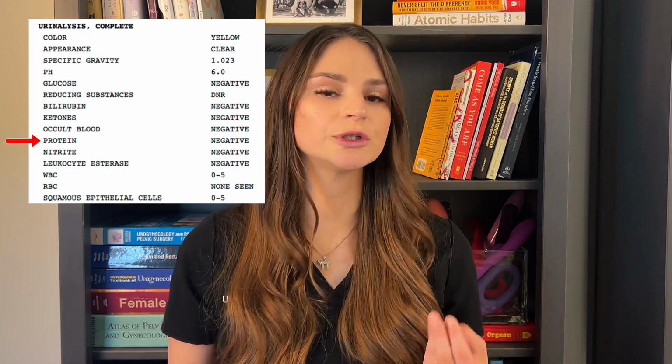Protein in your urine. Normally, you should not have protein in your urine unless there are some issues in the kidneys, or you eat more protein, or there is an infection, or for women who are pregnant, for example, if they have preeclampsia, eclampsia. So if you have protein in your urine, make sure to follow up with your doctor for a possible underlying condition.